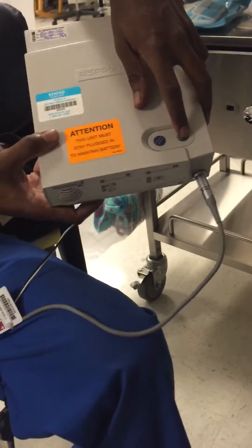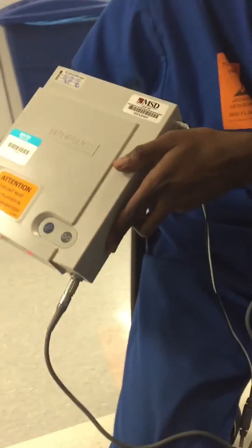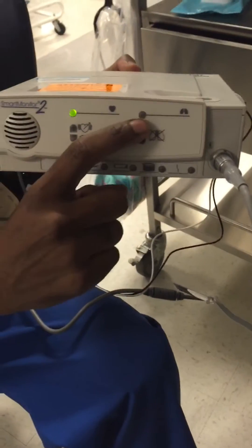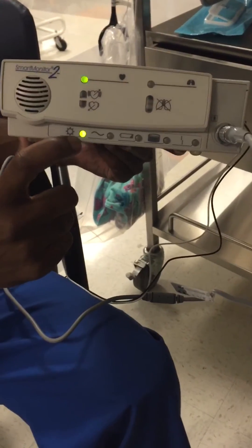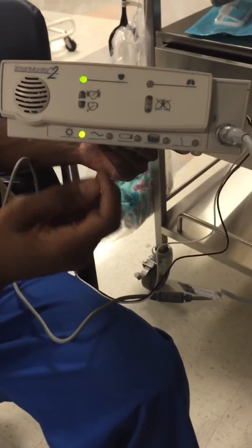I'm going to press the power button to turn it on — it's really loud. This is what it's going to be like when we put it on the baby. The blinking lights: baby's breathing, baby's heart is beating, and the power light. I don't have it plugged in, so that's why the charging light is not on.